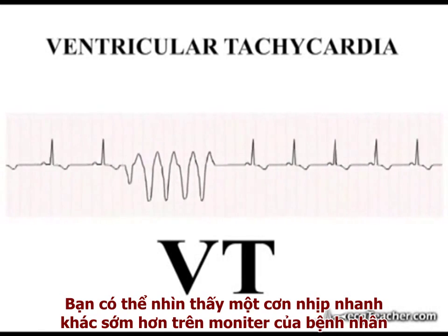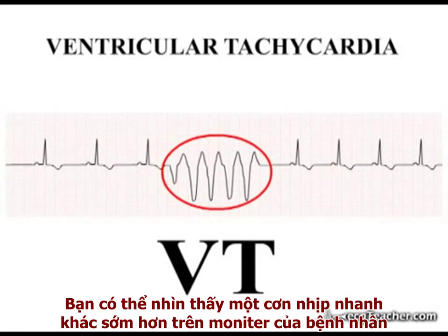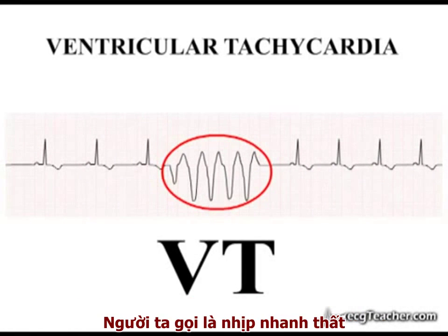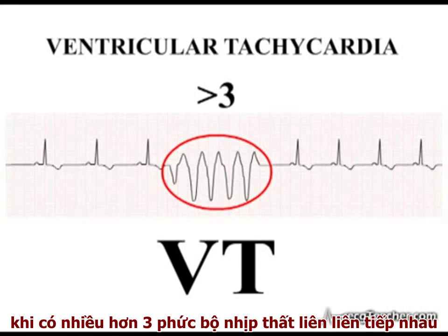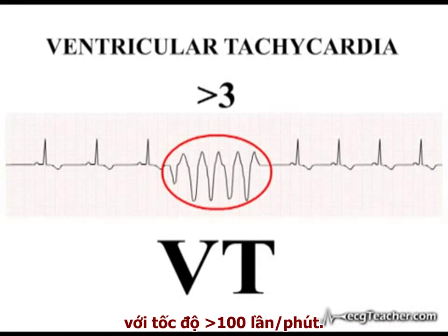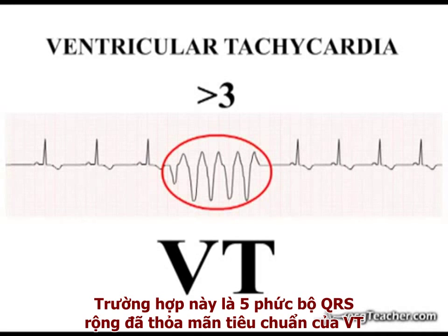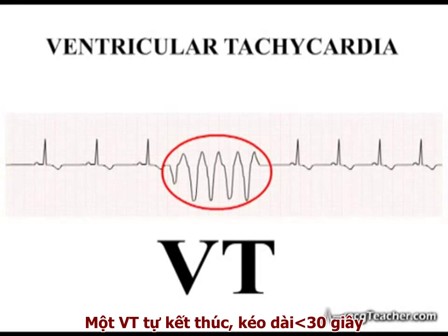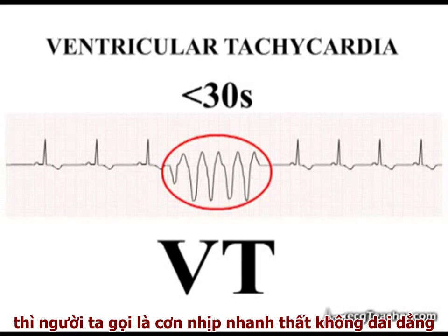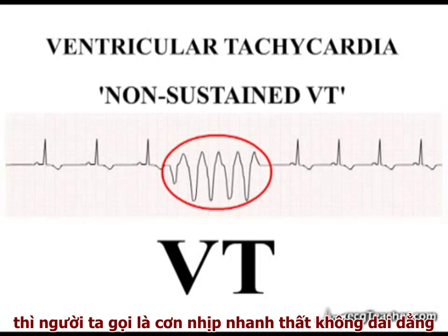You may have spotted this earlier event on the patient's monitor. Ventricular tachycardia is present when more than three consecutive ventricular complexes occur at a rate of greater than 100 beats per minute. This run of five broad complex beats meets this definition of VT. Such a self-terminating run of VT less than 30 seconds in duration is referred to as a salvo of non-sustained VT.